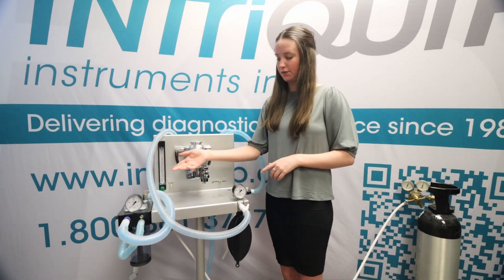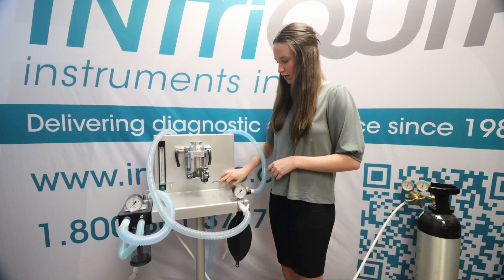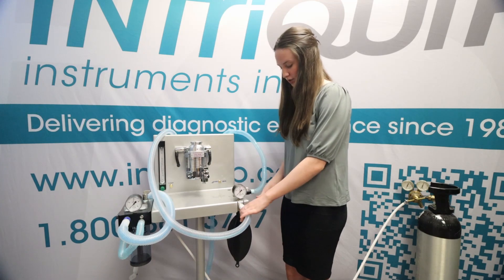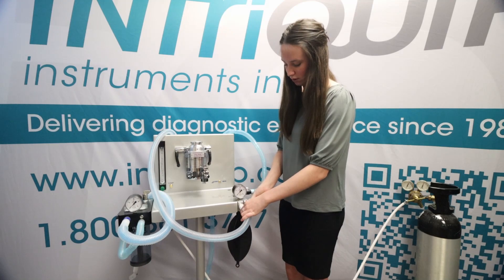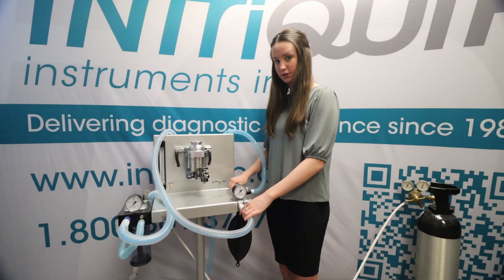Next, you're going to identify which circuit you're going to be pressurizing or testing by using the switch over here. Ours is switched over to the Bain circuit. Next, you need to attach your patient circuit hose and attach the oxygen supply line right here. Make sure that your breathing bag down here is attached as well.